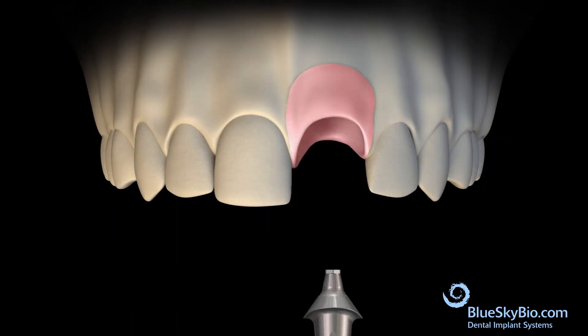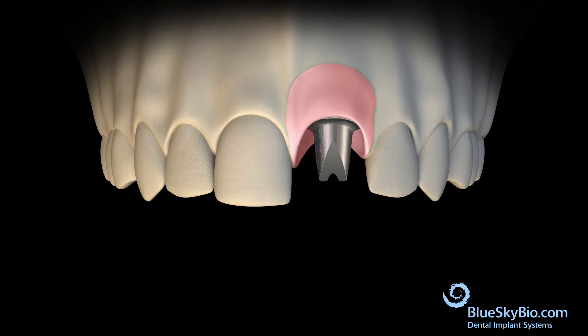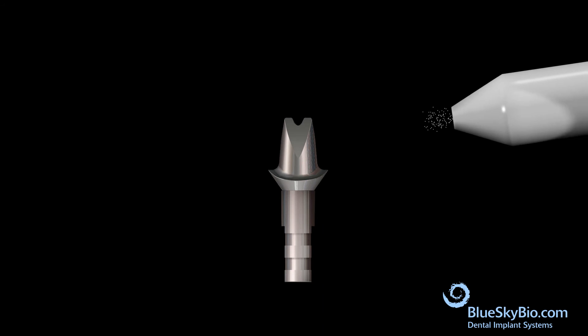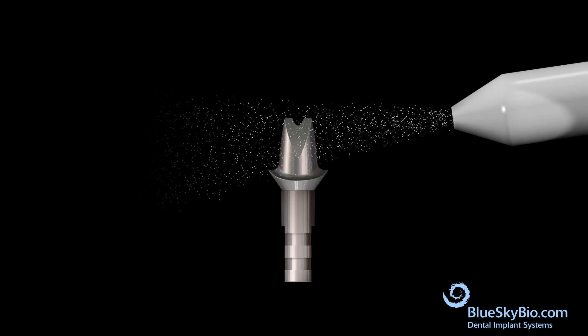Place the abutment into the stone model to verify the fit. Remove the abutment and place it onto an analog. If desired, a white resin material can be applied to the abutment. Sandblast the crown retaining surface of the abutment.